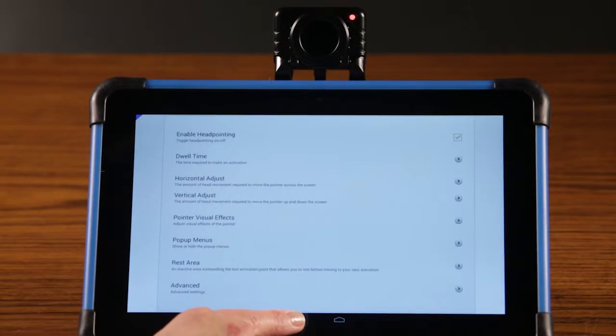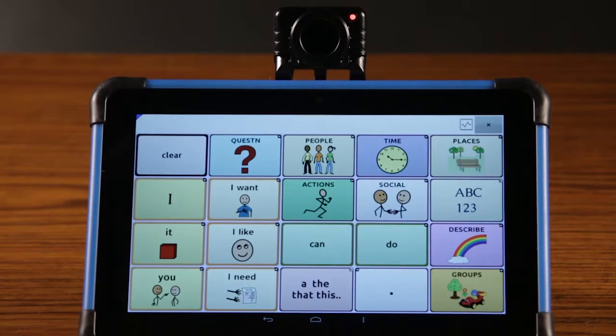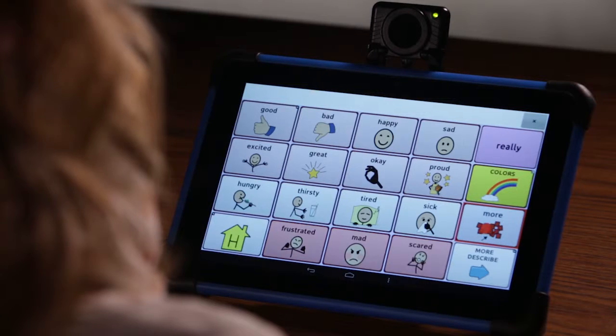As a rule of thumb, the larger the pointer, the more transparent you would want it to be, and vice versa. If you are using a larger pointer, you would then also want to adjust the opacity.